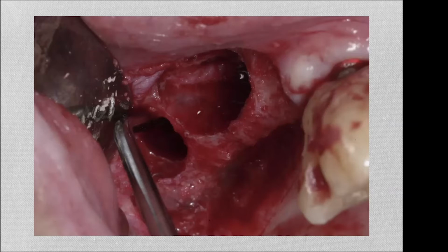If you break it, it's not really a success, because that piece can then pierce the sinus mucosa and you end up with bigger problems. You're better off kind of glancing and avoiding it.